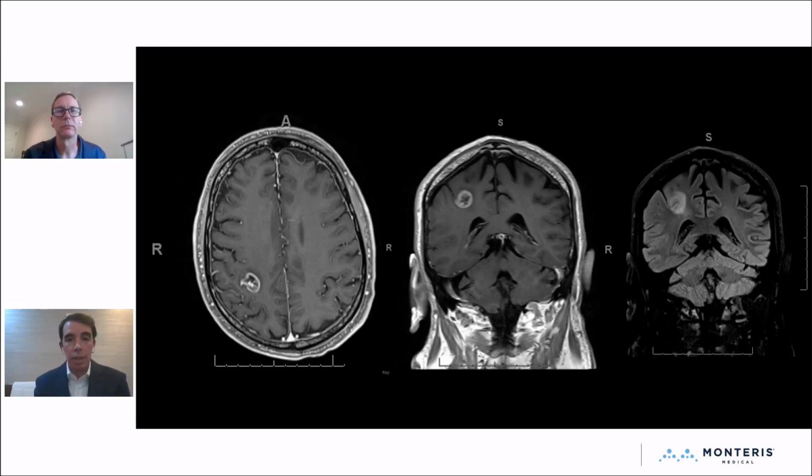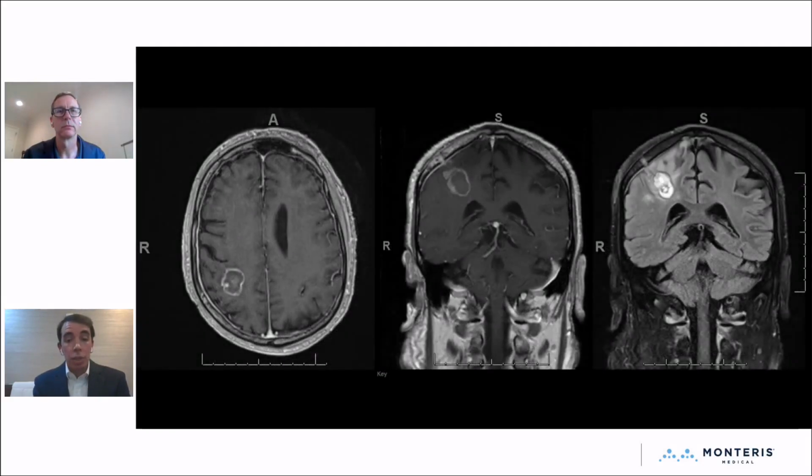It's small, it's deep, the patient had excellent performance status, 3 of those clinical features that Dr. Groot just reviewed. This patient got imaging about 6 weeks into therapy, and again, LITT was performed for that lesion. There was no delay to initiation of concurrent chemoradiation. The patient's therapy and radiation began within 6 weeks of initial biopsy, so no delay.